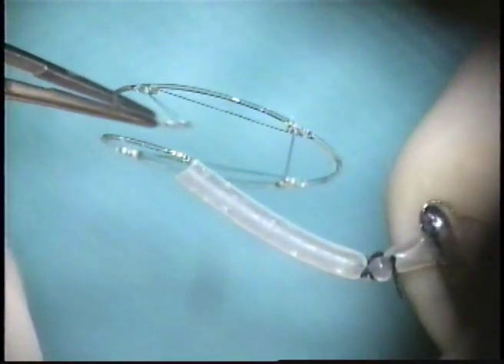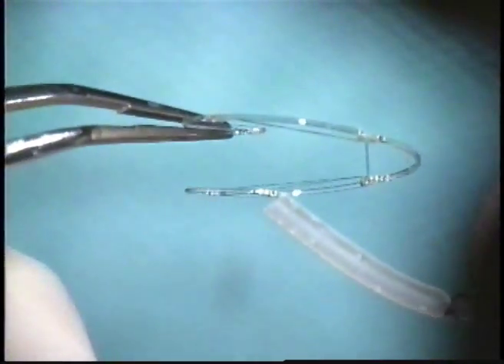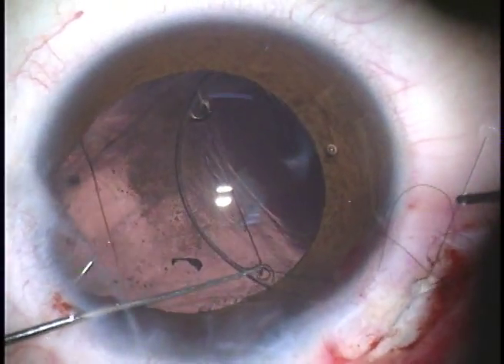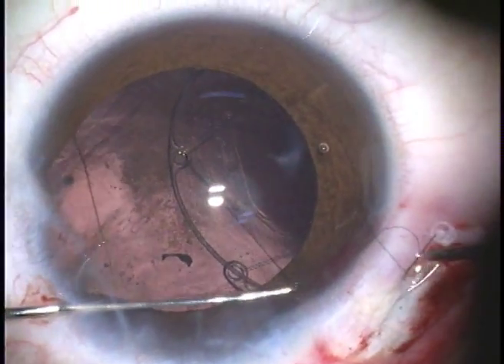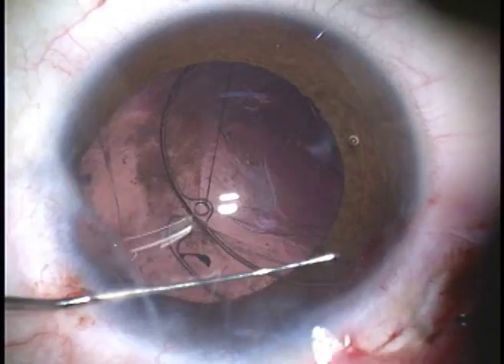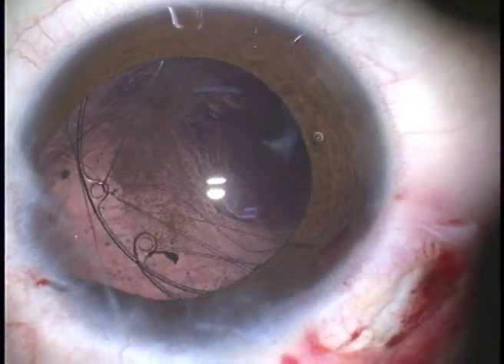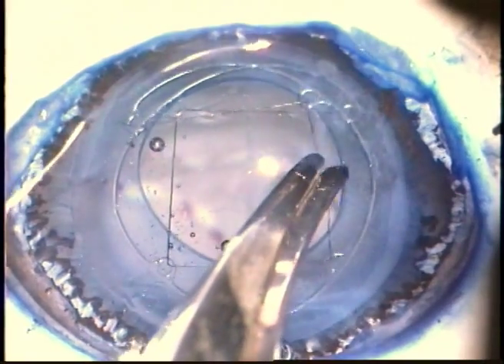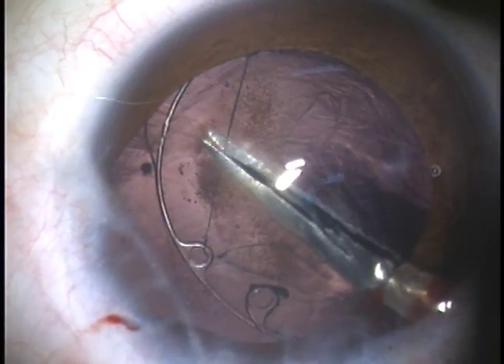The ring remains as an open loop as the cord never crosses between the terminal eyelets. In this way, the ring can be dialed into the anterior chamber and into the capsular bag in its reduced state. Once the ring has been placed in a convenient location, the tensing cord is released allowing the capsular tension ring to expand into its final position.